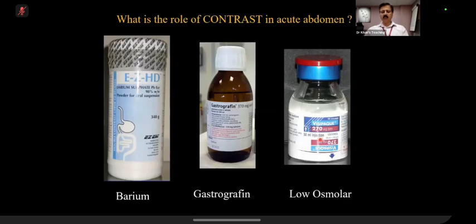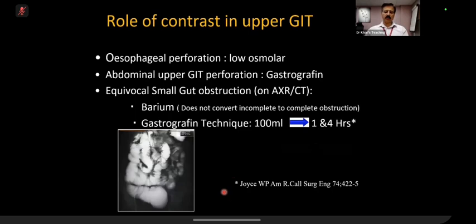Now, if you see here, this is Visipaque. There can be many, Omnipaque, etc. And on some of them, if you see the words oral use written on them, they can be used intra-arterial, intravenous, as well as oral.